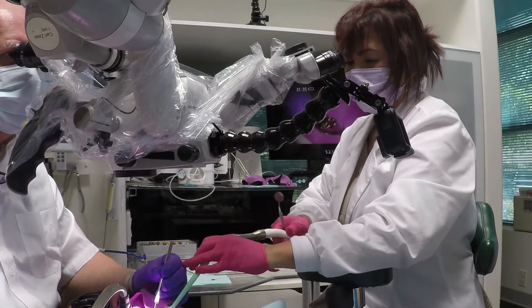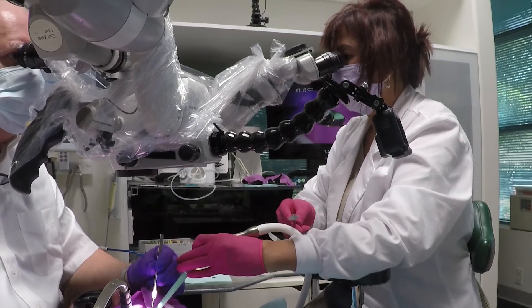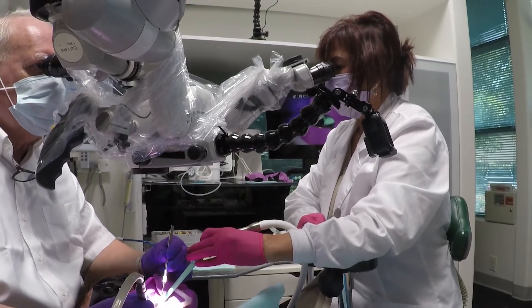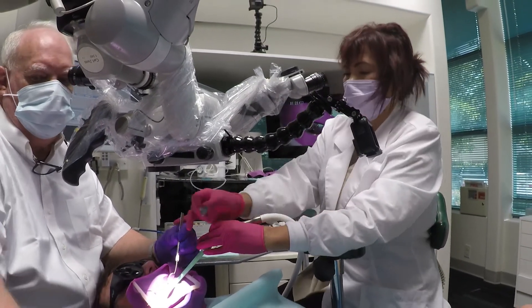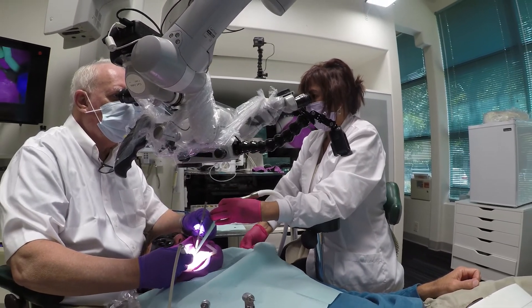Here from another angle, you can kind of see the level of her arm, how straight she is, and how comfortable her arm position is when she's exchanging instruments or suctioning. Thank you.